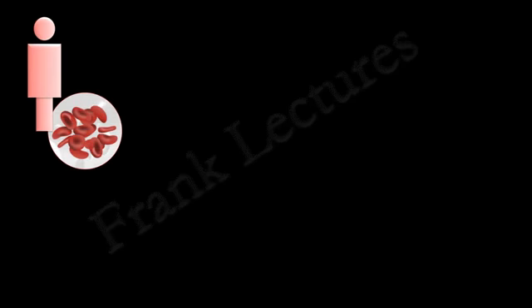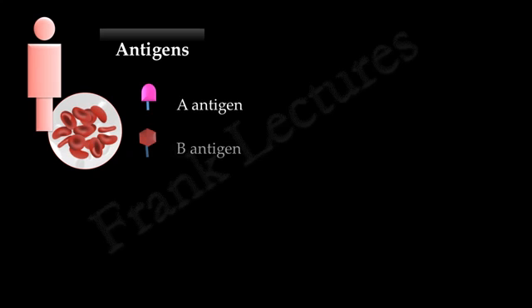For this test, we will require few drops of blood from a person whose blood group is to be determined. We know that blood will contain the target antigens on RBCs. These target antigens are A antigen, B antigen and Rh antigen. We will detect the presence and absence of these antigens in blood and determine the blood type.